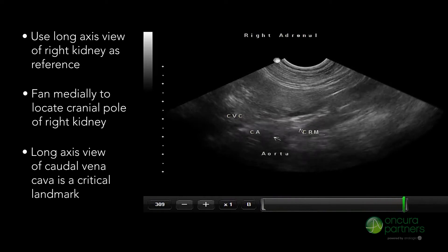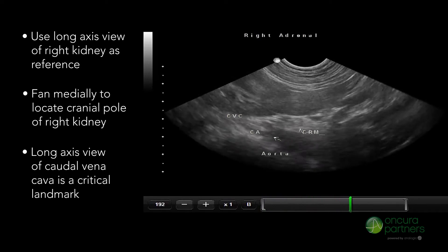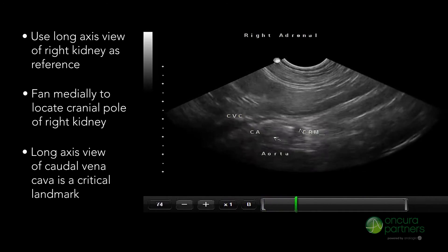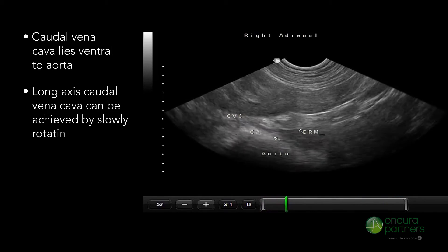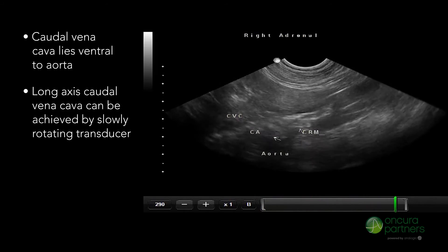The long axis view of the caudal vena cava is a critical landmark. Failure to locate it can lead to significant difficulty in finding the right adrenal gland. The caudal vena cava lies ventral to the aorta. The long axis plane of the caudal vena cava can be achieved by slowly rotating the transducer.